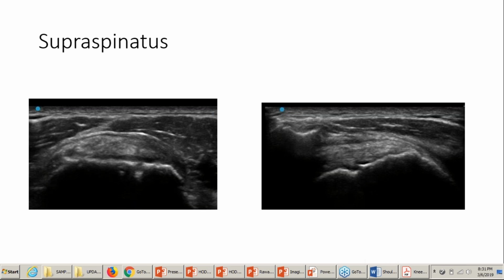If this tendon was just a degenerative tendon with no tear, you wouldn't see much of the cortical defect at the insertion site, and you would see swelling of the tendon and heterogeneous appearance. So we are lacking the swelling part, and we're lacking the bone part of the tendinosis picture. So we are thinking more in terms of partial tear versus just plain degeneration.